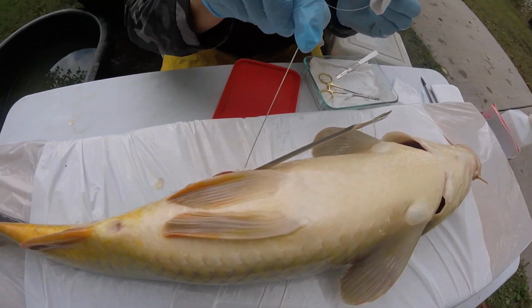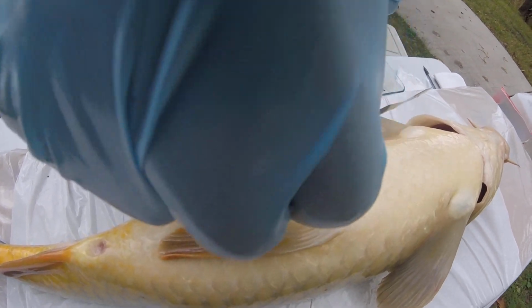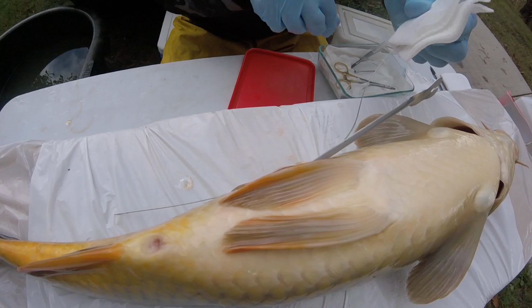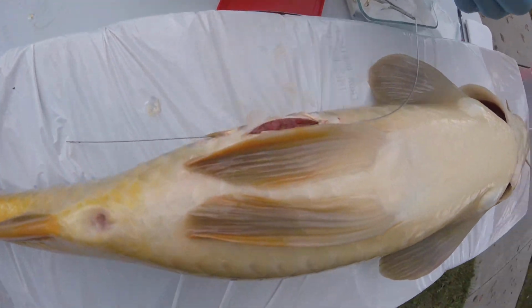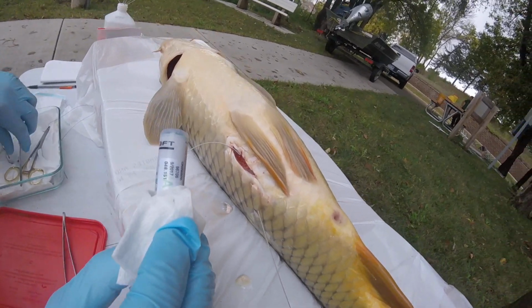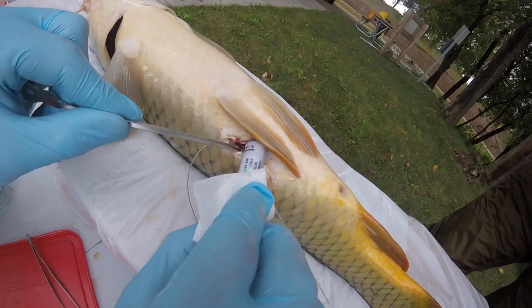So now this is going to be threaded through the hypodermic needle. Pull this out the back. Pull this out. Now I'm going to insert the tag. So I'm going to use this to kind of open up the cavity here.